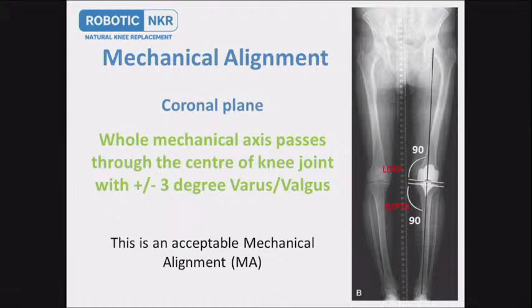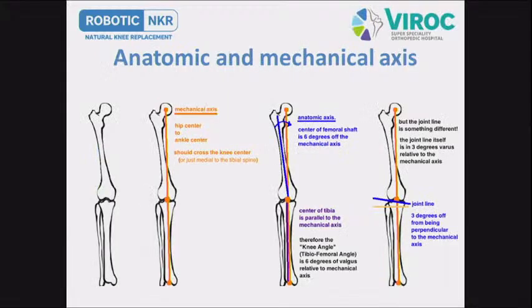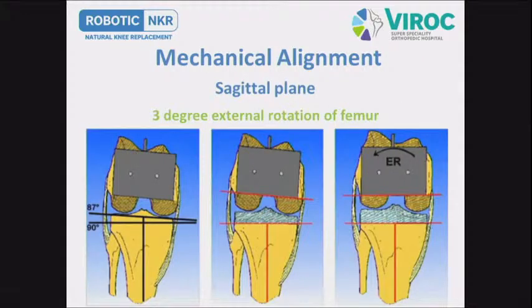Usual anatomy is not this. We should understand our routine anatomy is relatively an oblique joint line, with the distal femur in 2 to 3 degree valgus and the proximal tibia in 2 to 3 degree varus. To compensate for that, in the coronal plane we are cutting the distal femur and proximal tibia at 90-90. To compensate that, if we cut the posterior condyle equal, we will have a loose lateral gap.